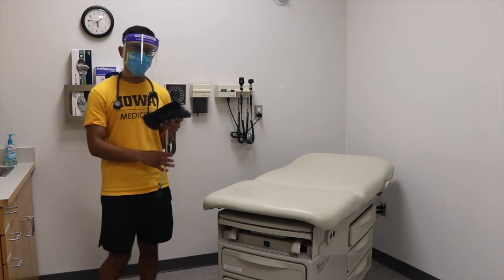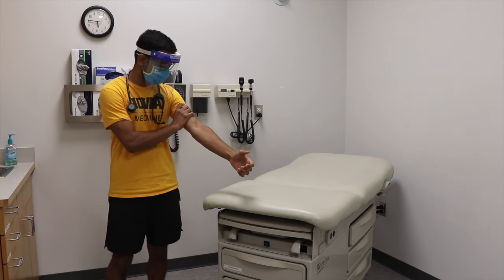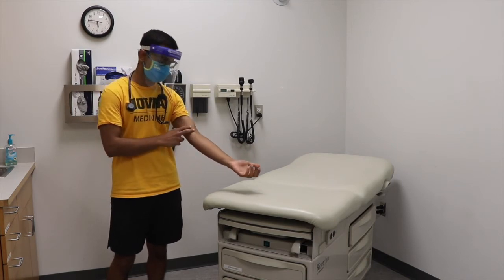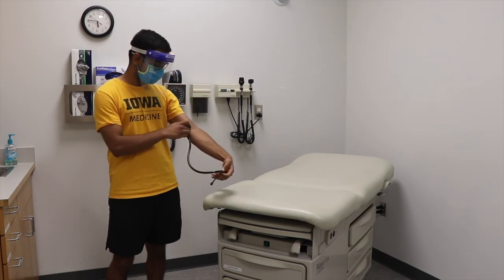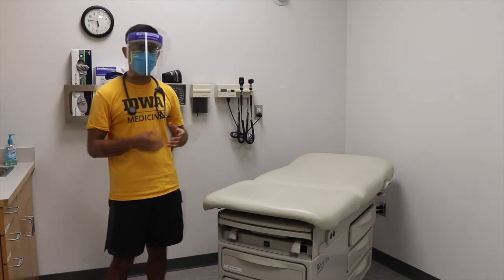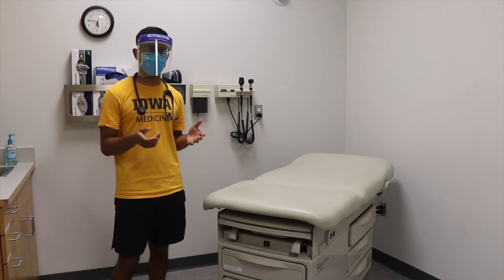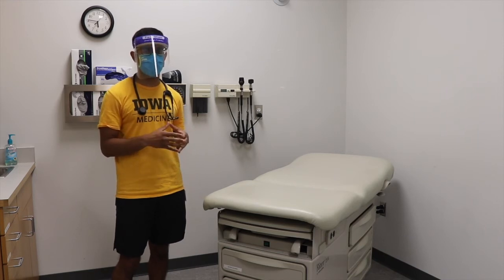Now the blood pressure cuff goes on the patient's arm. It's going to be placed right here and about an inch above the inner elbow, and the stethoscope gets placed at the brachial pulse. Now, what we're going to do is pump up the blood pressure cuff to about 200 millimeters of mercury, which is just a pressure value, and we're going to start to release some of the air, and we're going to listen with the stethoscope.